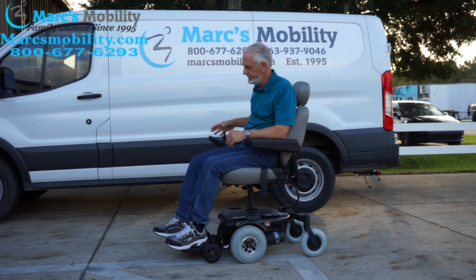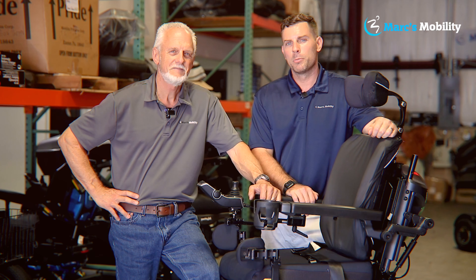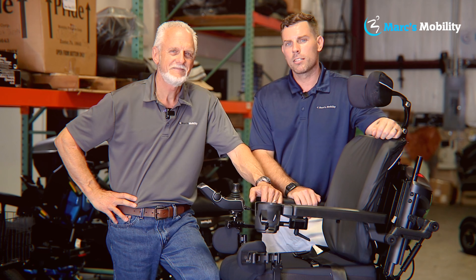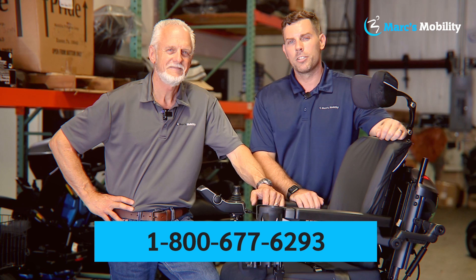The seat on this chair is 20 inches wide by 19 inches deep — a really nice, high-quality seat. It has the extra large foot plate, which is a little longer than most. When you flip the foot plate up and exit, there's nothing in front of you. Here is your reset button — if you ever need to reset the power, that's where it is.